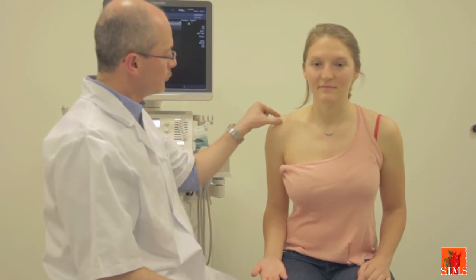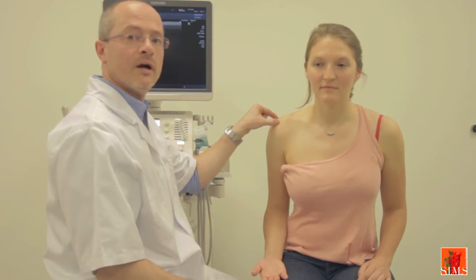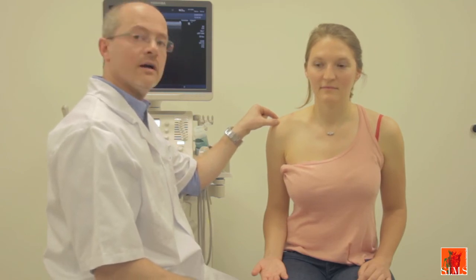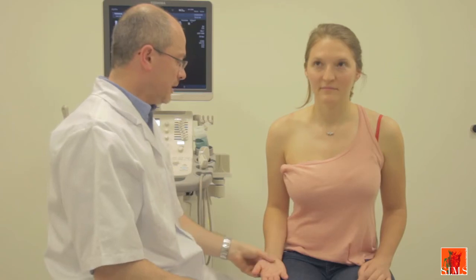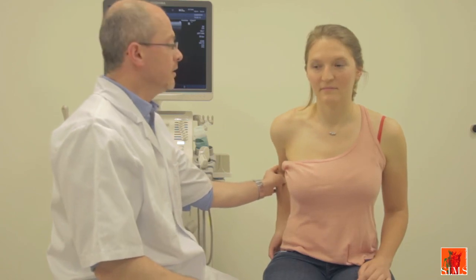Earlier we found, in the course of our anatomical study, that the acromion, that bony structure located here, interferes considerably with access to the supraspinatus. In order to free it, we must carry out the following maneuver. The hand is placed on the patient's buttock, resulting in retropulsion and adduction. Thus, the supraspinatus will be completely freed under the acromial protuberance.